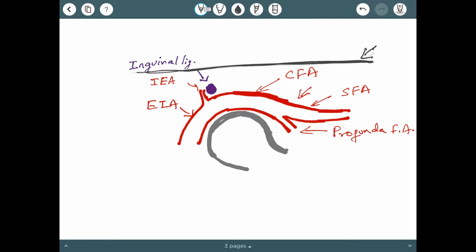So this is our surface of the skin. Our target is that we should puncture the artery over the femoral head. The reason is that if you are puncturing below, that means below the head of the femur, or puncturing above, there could be problems.